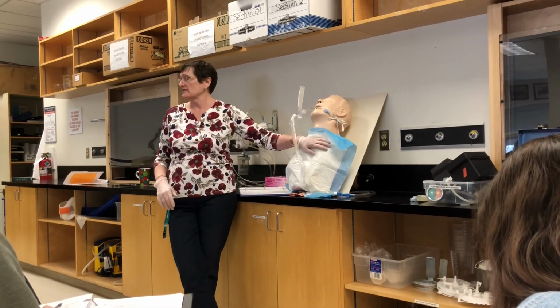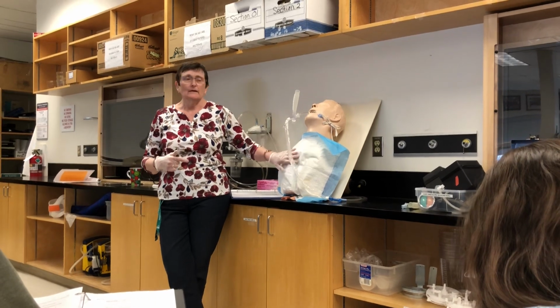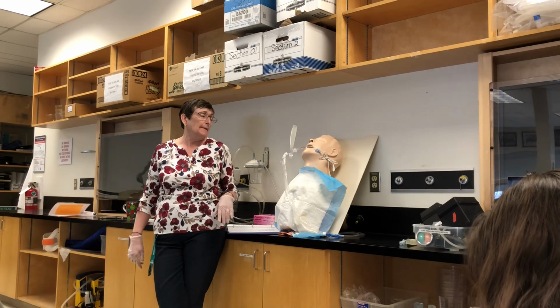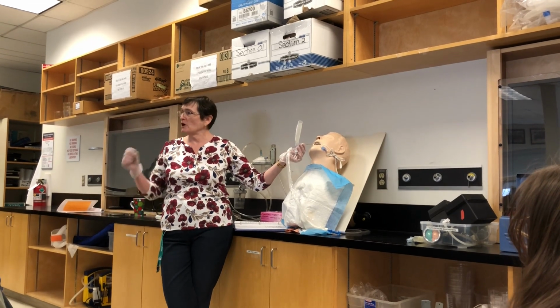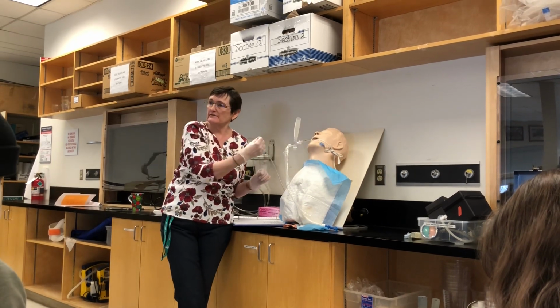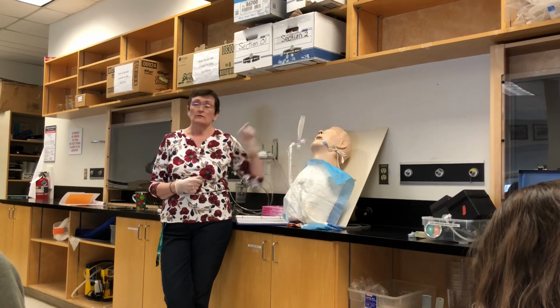So got everything ready, and then I'd listen to their chest. Okay? I'm going to auscultate and see, do we need to suction? Or can I get him just to cough? Okay? Before we get going. Okay? I'm going to say his chest sounds pretty clear right now. All right? If he has a VAP tube in, which this one does not, I'm not as concerned about secretions sitting above the cuff if it's functional, okay? But if he does have a VAP tube, I would disconnect it from the suction and clamp off the VAP connector, okay? Because he does not have a VAP tube in, I'm going to suction orally first.